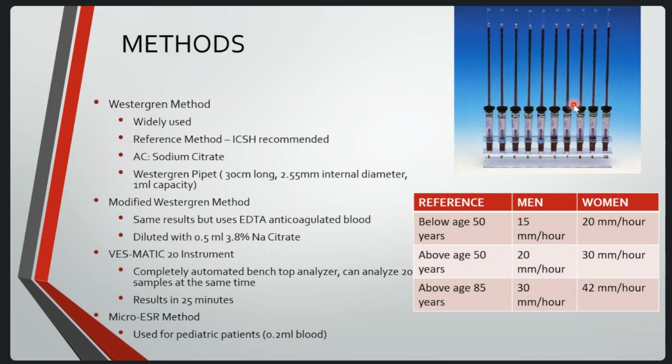This setup is our modified Westergren. Kasi yung Westergren method, ito yung parang may kahoy siya na box. And then lalagay mo talaga yung babalutin mo itong pipette. Tapos isi-secure mo siya. Ipapatay mo siya 1 hour.